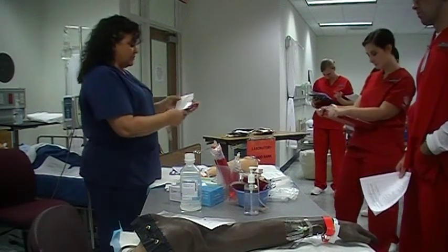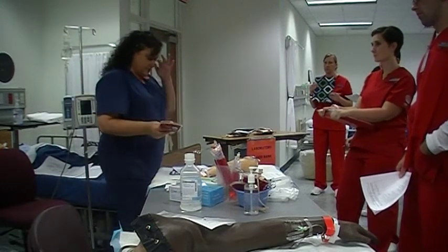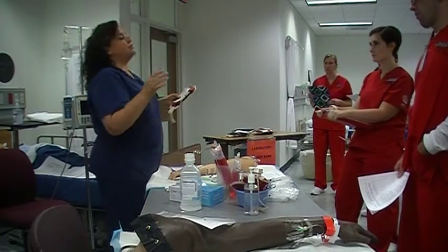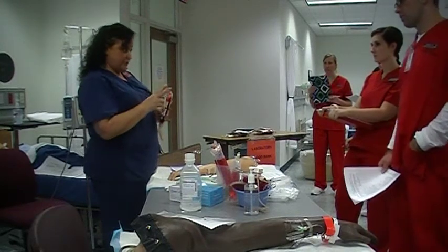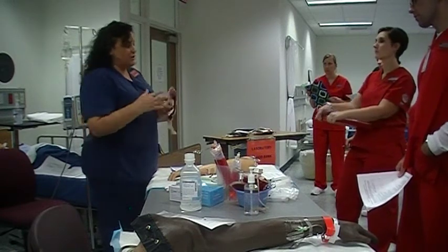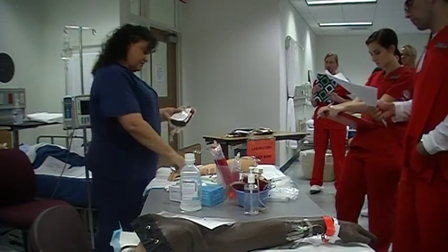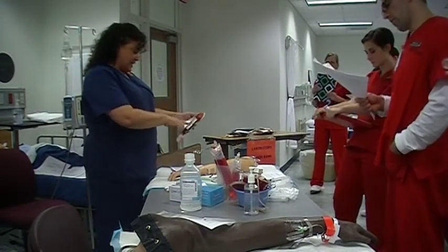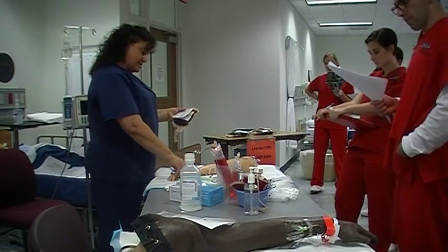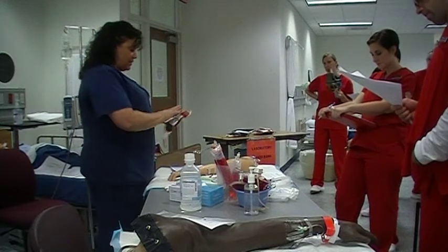When you're going into the room, you want to take a second nurse to verify the blood product with the patient. So I'm going to call in Nancy Nurse, and she and I are going to check the blood. When you're doing this skill, you speak for both yourself and your second nurse. You can't just say it and then wait for the pretend. You have to say it for the patient. Speak for the patient. Okay, so I have Robert Davis. Medical record number F00712-367. Medical record number F00712-367. Date of birth 3/25/1948. 3/25/1948. Okay, so all of that matches.